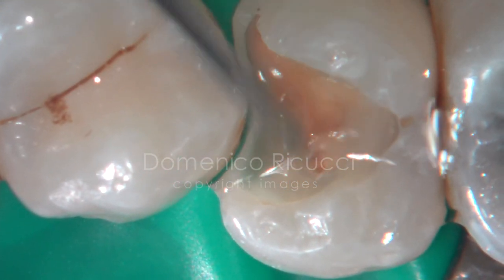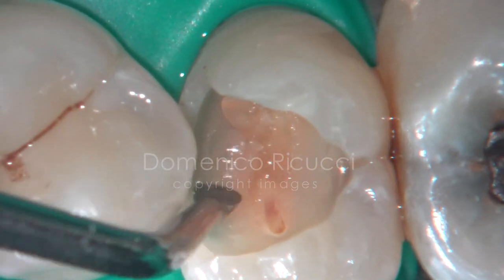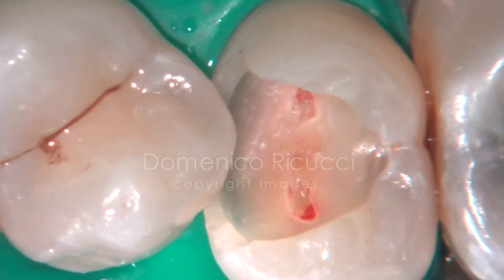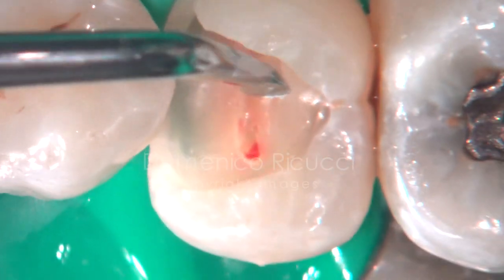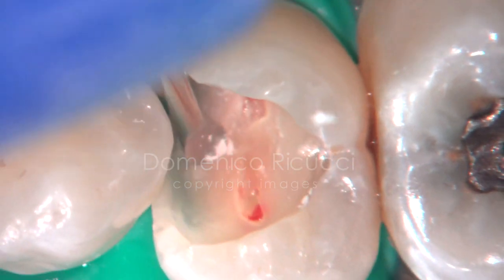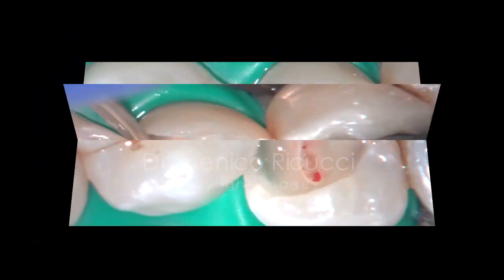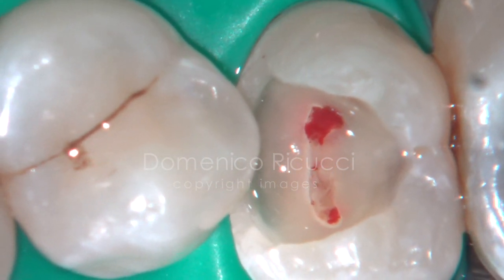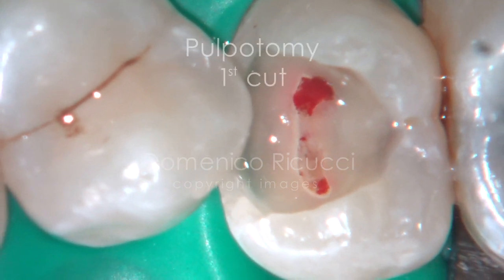Irrigation with 1% sodium hypochlorite. After complete excavation of the soft tissue, the pulp chamber roof is lacking and partial pulp necrosis can be observed.